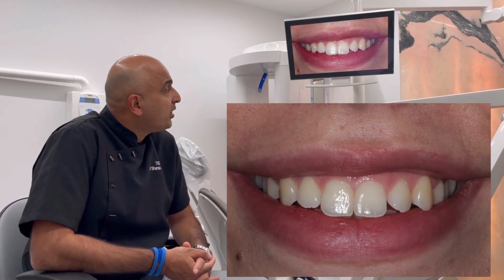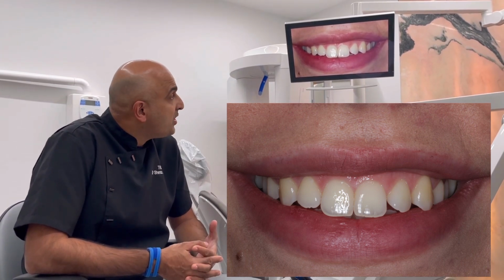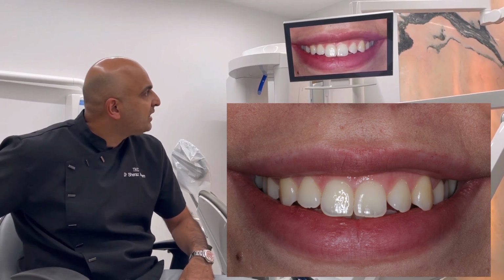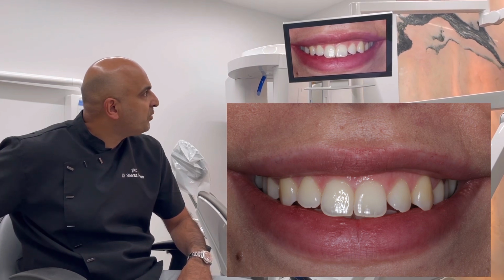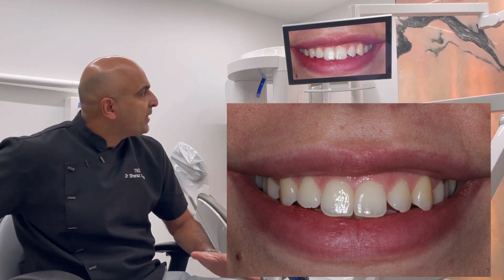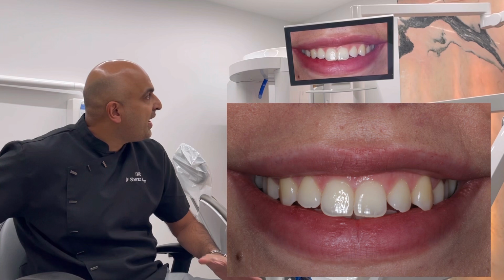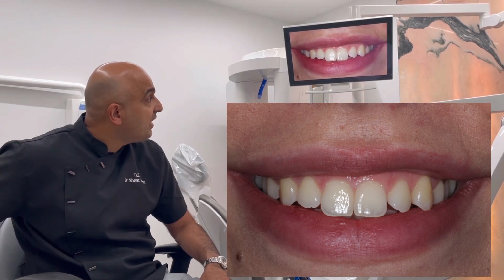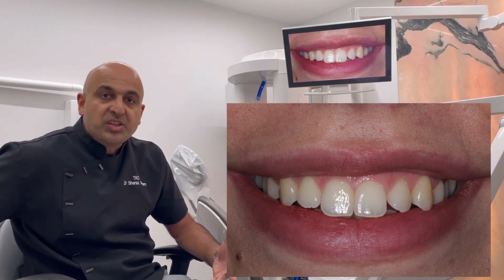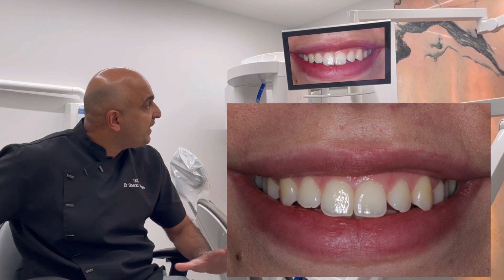I'm going to go through what the patient's concerns were and then how we look to tackle it. The patient's concerns were that the teeth are proclining, which means they're sticking out slightly. They also don't like this tooth nor this tooth sticking out, and they're asymmetrical. From my perspective, because we offer a full spectrum of cosmetic treatments, I'm checking each individual tooth to see how they look and how they compare. Initially, I could see straight away that these two teeth are not your typical lateral incisors. They're a bit wider and shorter, and I knew this was a problem for the patient without them realizing it. So we had a long discussion about this and I said, look, I can fix the alignment of your teeth with Invisalign.